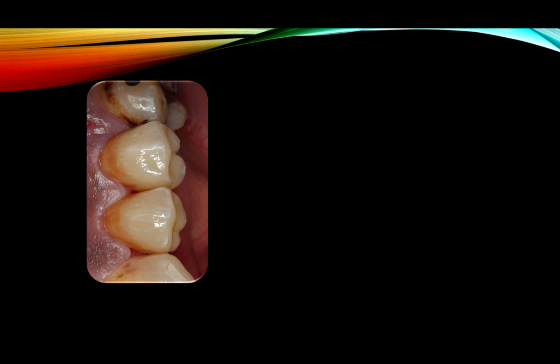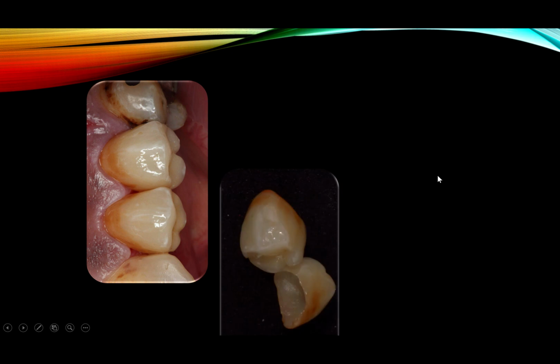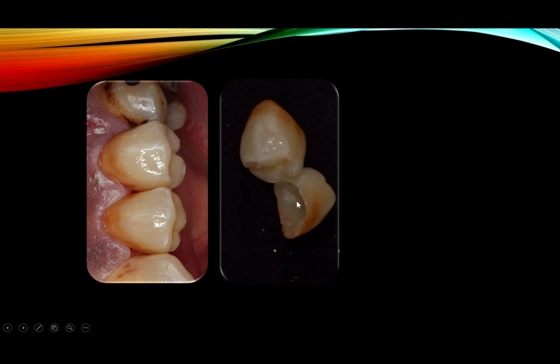All right. And all of this characterization was obtained by stains and then a double glaze on top of it. In other words, if you look inside, you only see the one color, whatever this is, B2 maybe, A2, but the rest, it's all just stains.